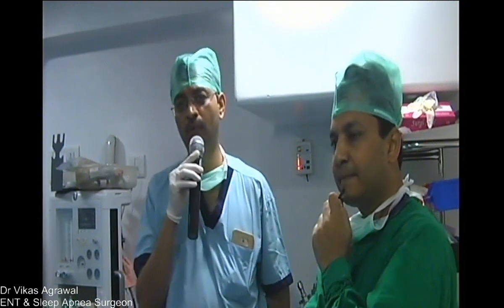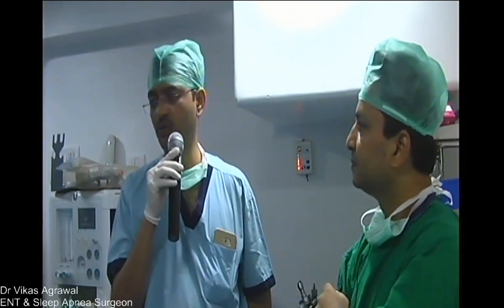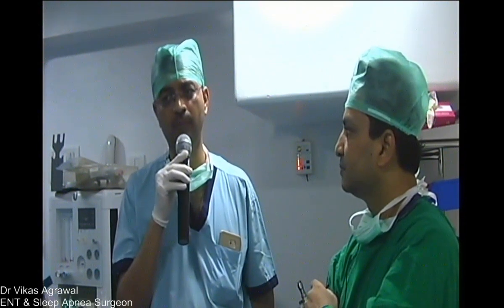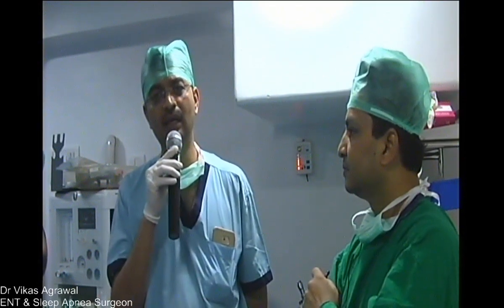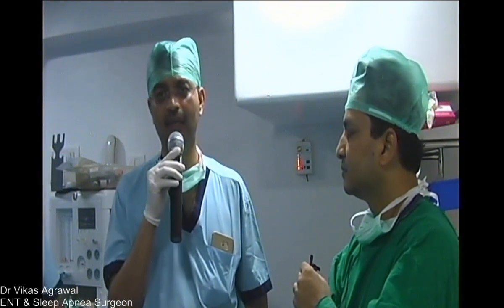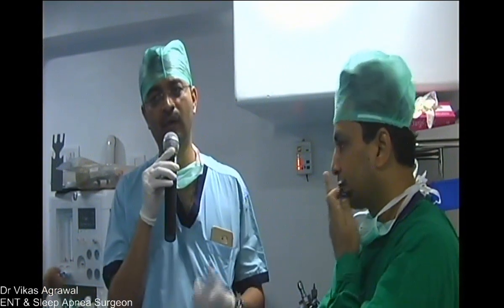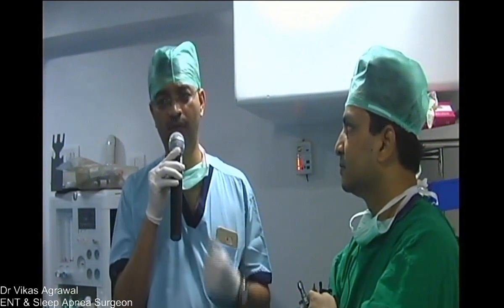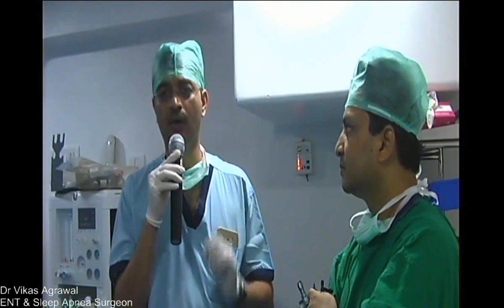By doing video laryngoscopy, we get the vision nearer to the tip of the laryngoscope. The video laryngoscope which we are using and recommending is the TruView video laryngoscope from Truphatek, which has a 45-degree angle to the laryngoscope blade. Now this angle is very important to get away without a major manipulation of the neck and without a major requirement of space inside the mouth. Here the anatomical situation is that we have a large tongue. Now a large tongue is often an obstruction to the vision also, in spite of having a good normal laryngoscope.